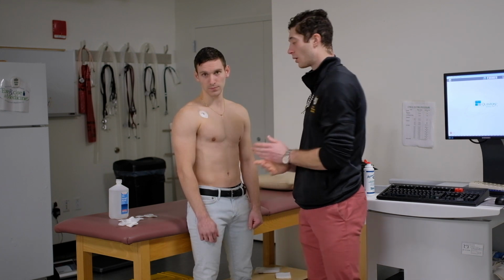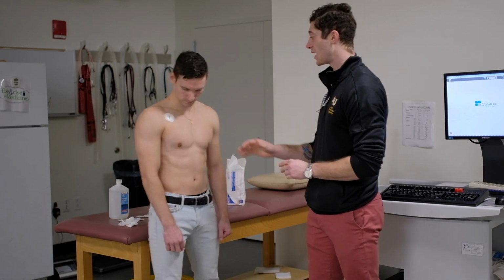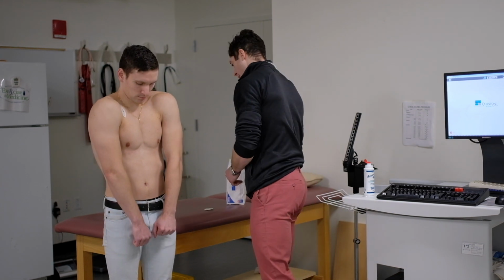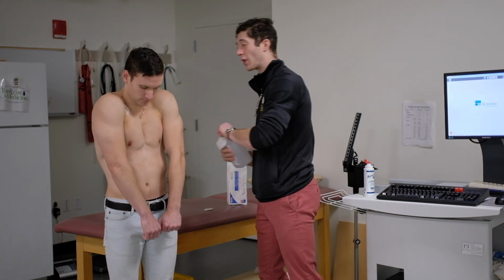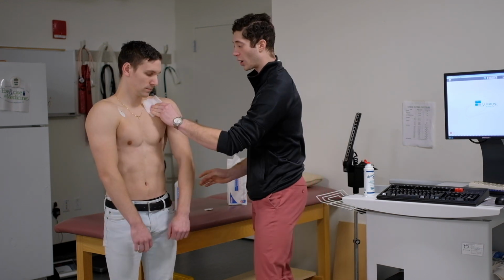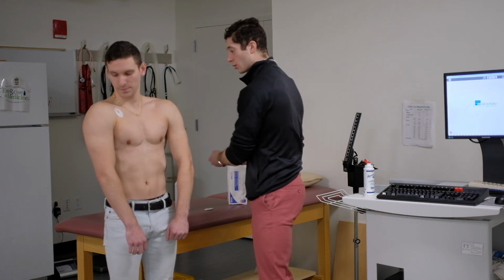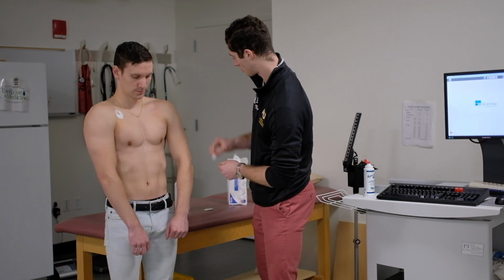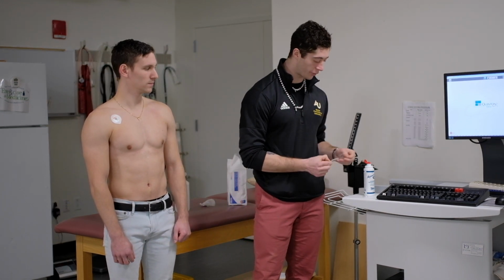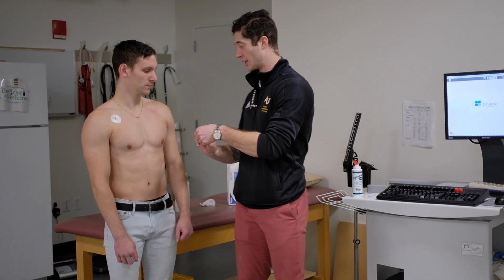We'll go through the next few now. The left is the same place on the opposite side, and so we can follow that process the same way. Take a piece of gauze, go ahead and apply alcohol, wipe down the area, dry it off, and after placing ultrasound gel on the electrode, you can go ahead and place the electrode on.